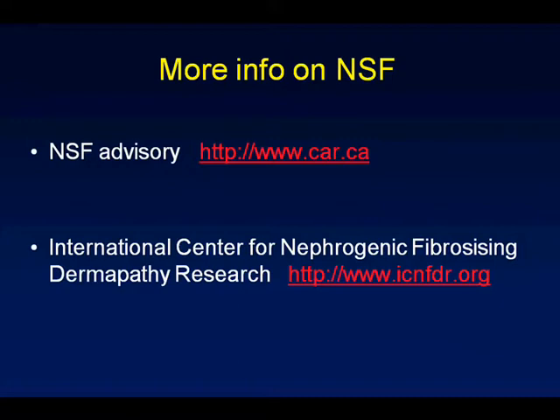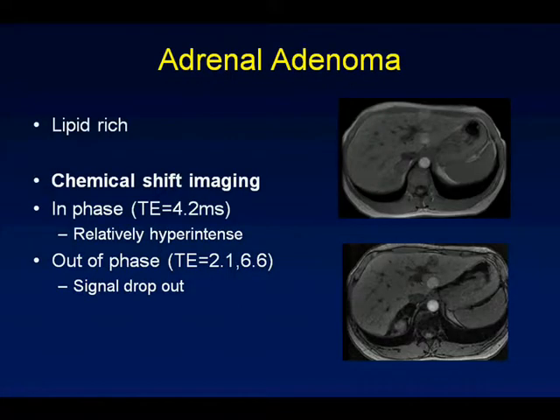Okay, so now that I've scared you into ordering MRI, I'm just going to go over some of the new MRI techniques that are available. As I go through them, I'm also going to go systematically through the GU system, to give you state-of-the-art current imaging, where we're at with MRI, and any of the new techniques that may be helpful.